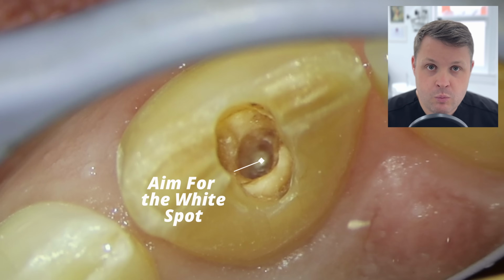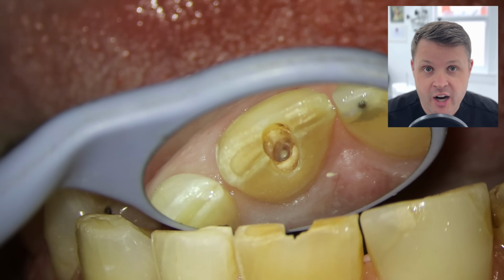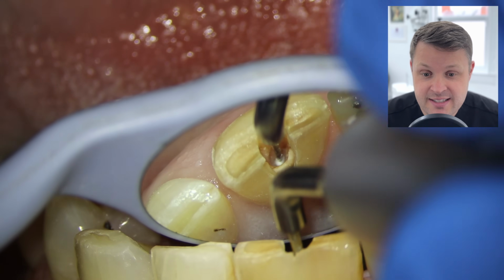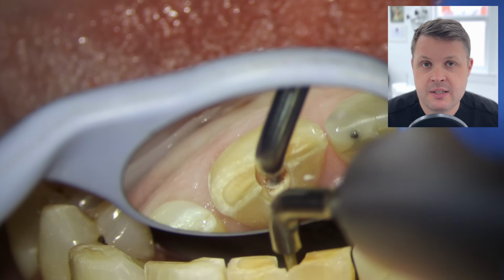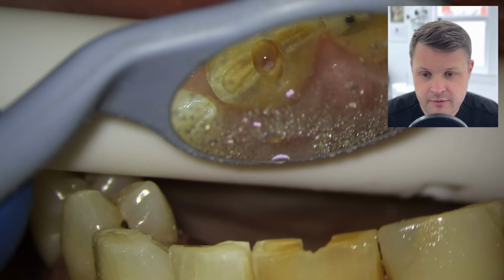And what I would say is you want to be aiming for the white rather than the dark. So the white is essentially the sclerosed or calcified tissue, and the dark is essentially the dark part of the dentin. That's what the root looks like. It's dark. So I'm going to have another fiddle around here with these diamond-tipped ultrasonics, giving it a bit of a clean out, maybe using a paper point to have a little look around.